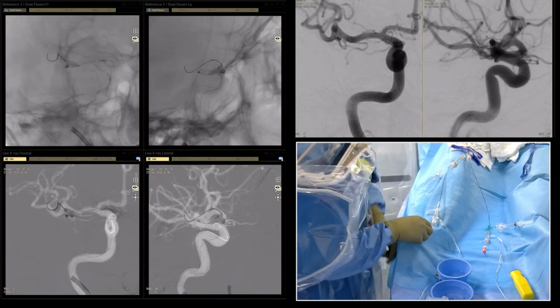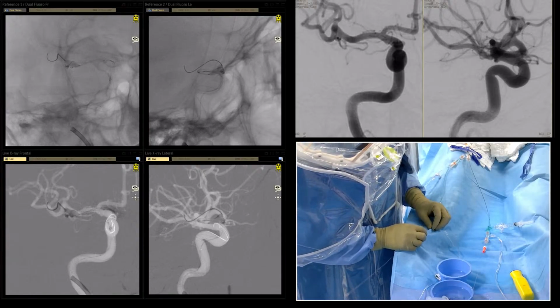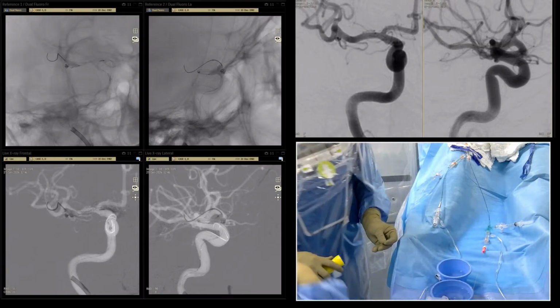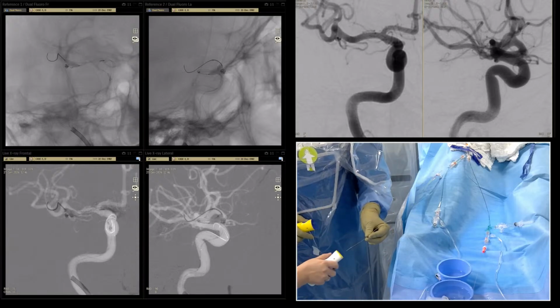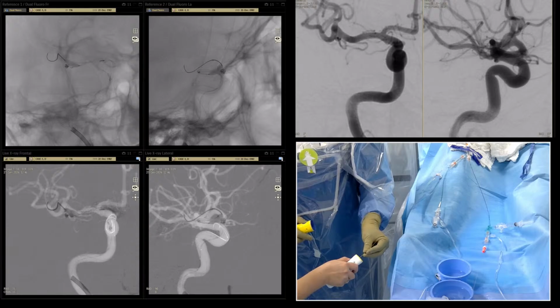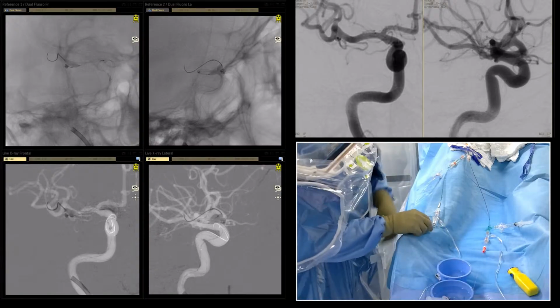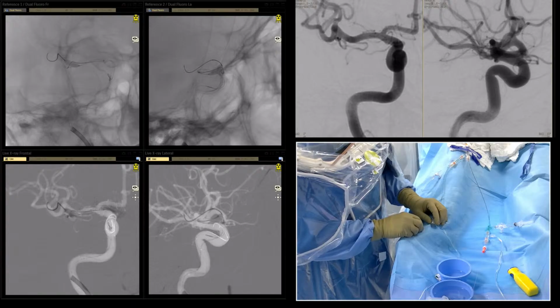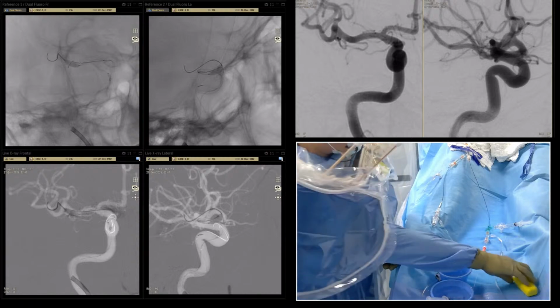That's why I prefer to work with the... Why it's like this, huh? No. It's not so reliable, huh? It's a detacher for web system and it's not detached, unfortunately. Let's try to detach one more time.